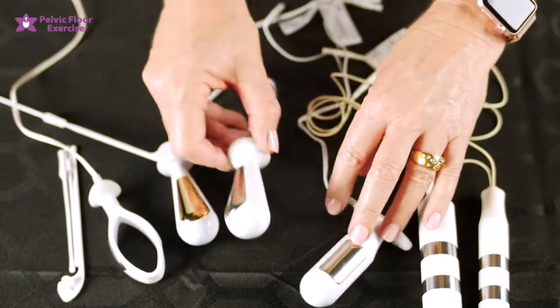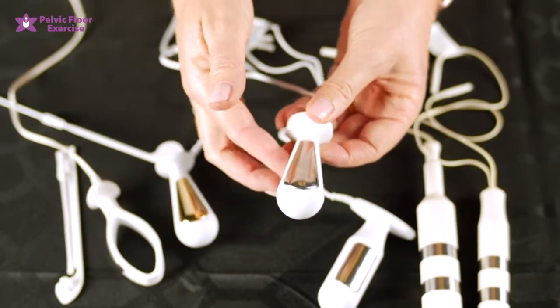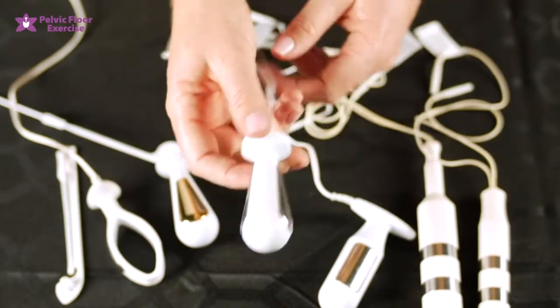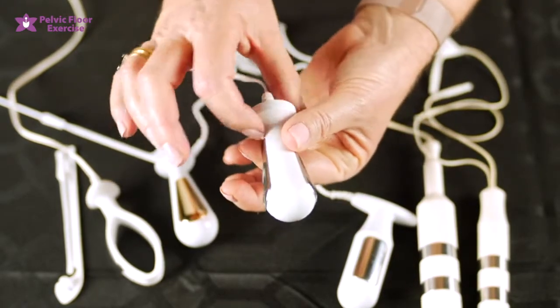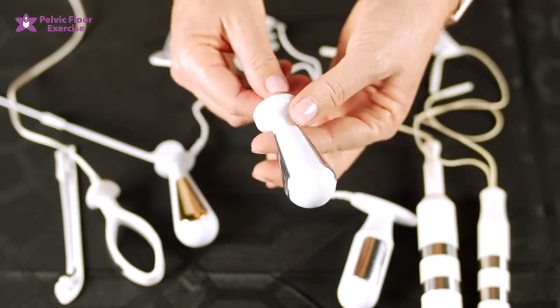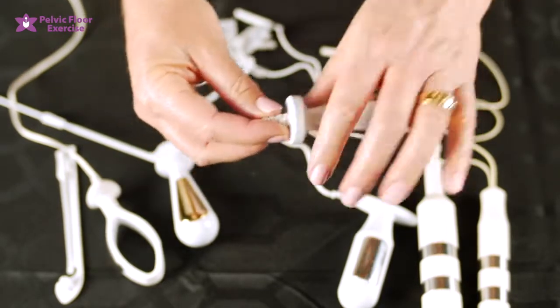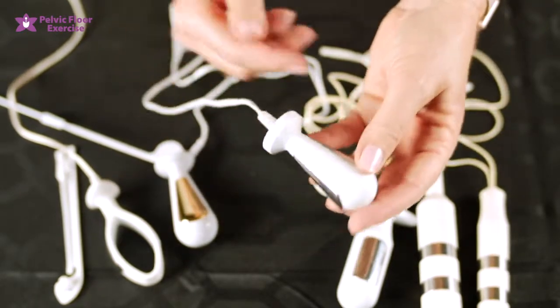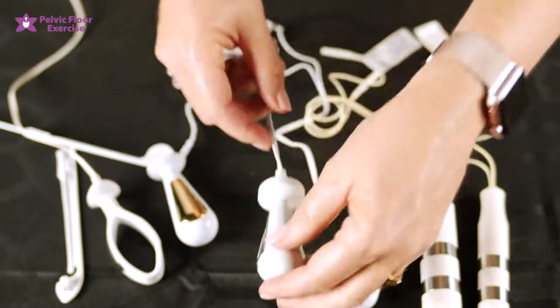Moving on to the PR02 — as you can see it's a more rounded shape but tapered in. We've got some quite large plates on either side. This can be a good one for pelvic pain patients. Once it's in, it's less likely, because of the tapering, to want to slide out, so it can be held in quite securely. The only problem with this one is you're not really sure once it's inserted what the orientation of the electrodes are, so you just need to ensure as you insert that you can remember where they are and go directly in.